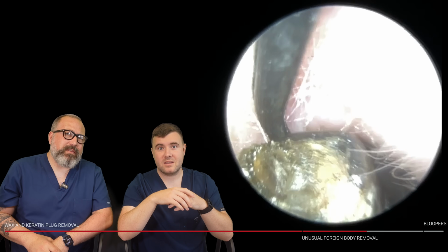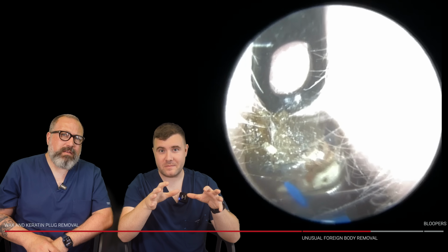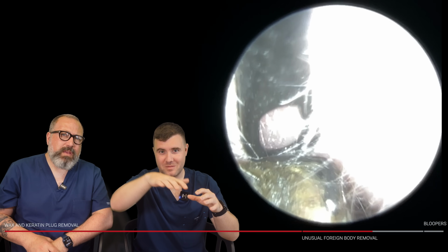Yes, it's going to be almost impossible because it's just flicking back into place so quickly. The thing is, it's not designed to be at this angle in the ear canal, that's the thing. Oh my gosh, that is so solid in there. Bless her. It is, yeah. So it's the Jobson horn which works here. So you can see I'm wiggling it just to try and work my way back there.